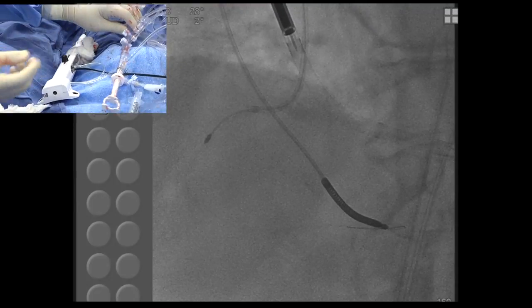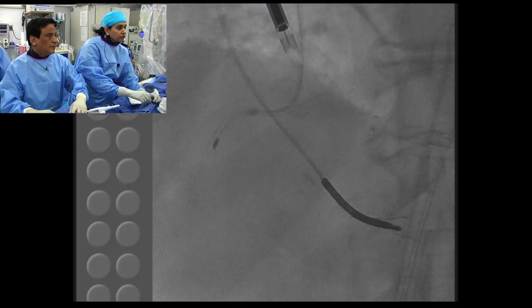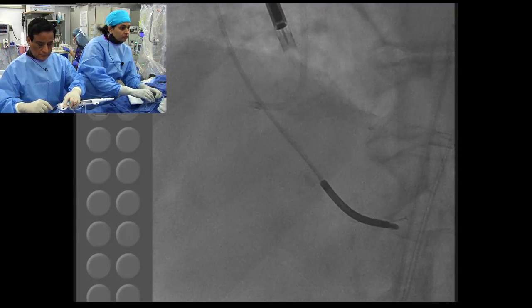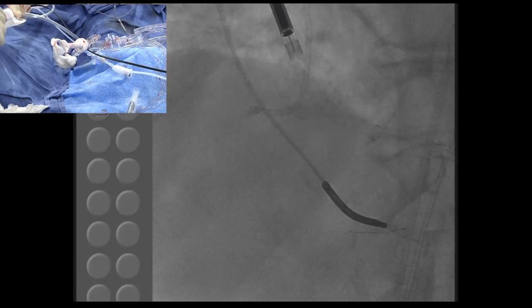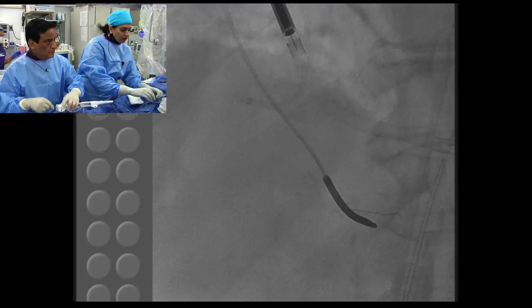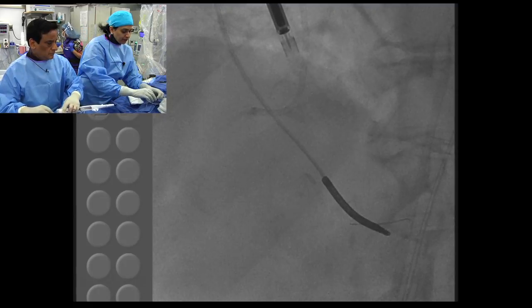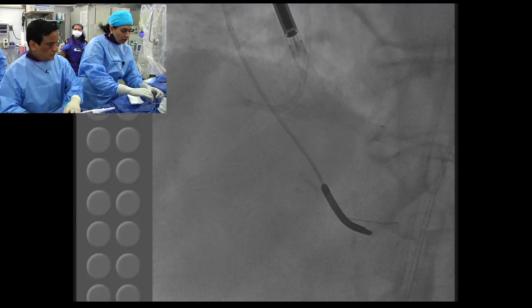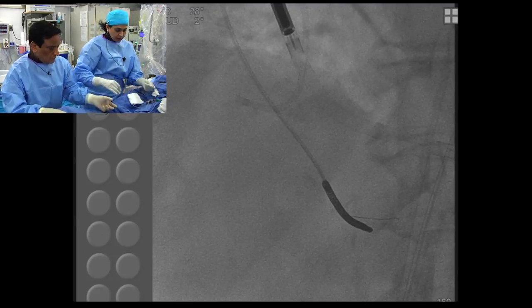Take it out. Okay. Get a 1.25 burr. That was a very nice observation you made. I think viewers should benefit from that: there is a certain tactile feel to it, and you start getting that feeling that it's probably time to downsize. Yes, go ahead. Another thing is also, once you see that kind of wire bias, even though the FineCross went, just doing a 1.25 burr and taking a shelf of the calcium from that tight lesion should be enough.